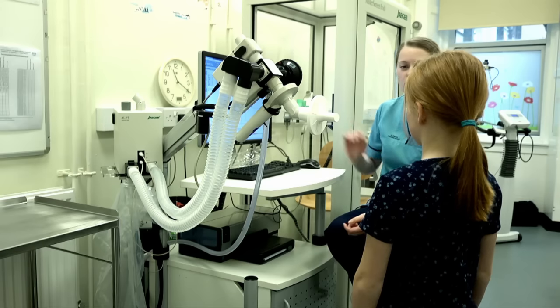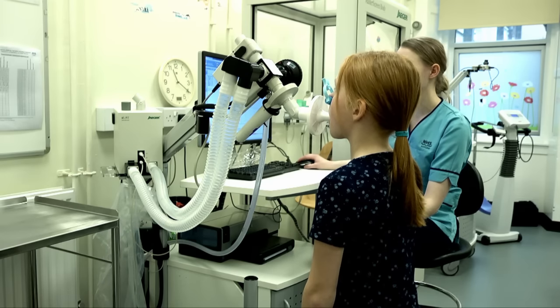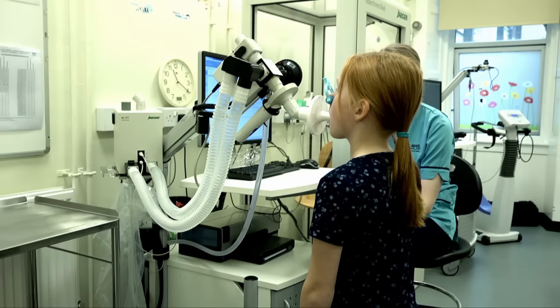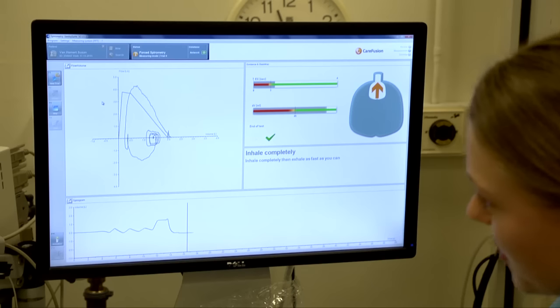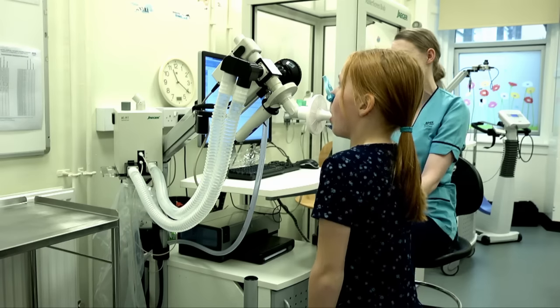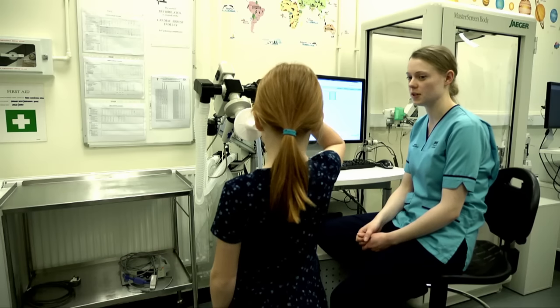Yes. If you want to put your lips and teeth around the mouthpiece now, that's it, and close your lips round. Perfect. We're just going to start off with nice normal breathing, so just in and out nice and normally for me. That's really good, well done. Now take that big breath all the way in and blast out all the way as long as you can. Keep going, keep going, and a big breath all the way in again, and off you come and have a rest. Well done. That was good. That's us ready to do the next test now.